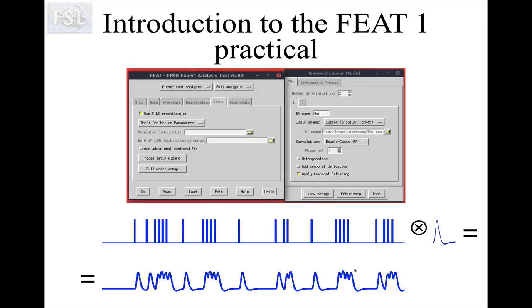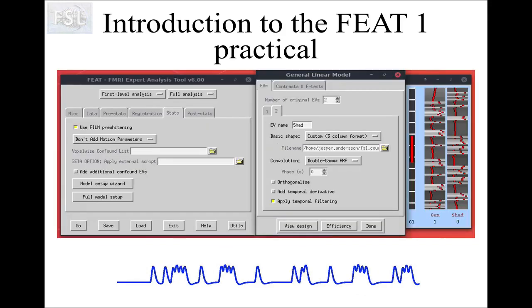The next step in setting up the model is to specify the hemodynamic response function. You do that in the GUI by selecting 'Double Gamma HRF'. So the onset file gives us the train of sticks, the Double Gamma HRF gives us the HRF shape, and FEAT will perform the convolution for you to generate the predicted response in the brain, which is what we use in our model.